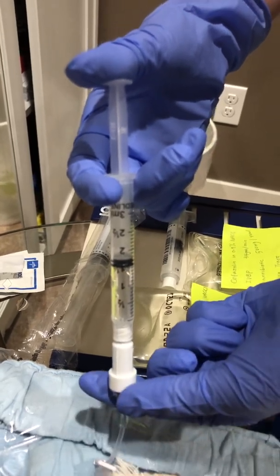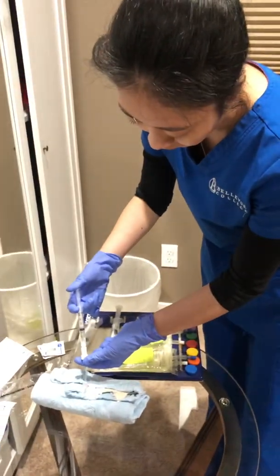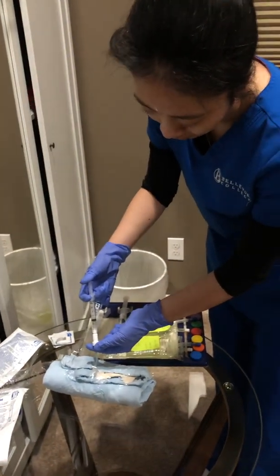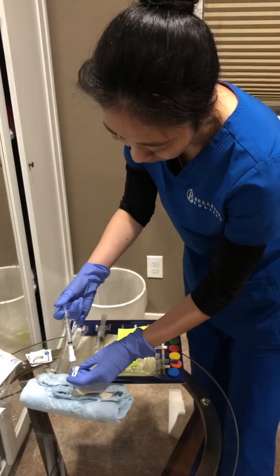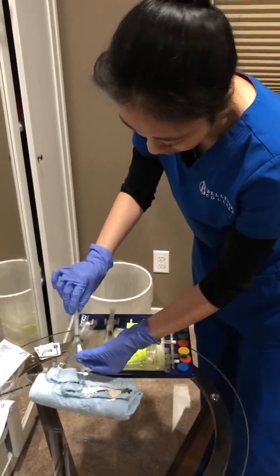Very slow. One minute passed. And 2 minutes passed. Lock it.